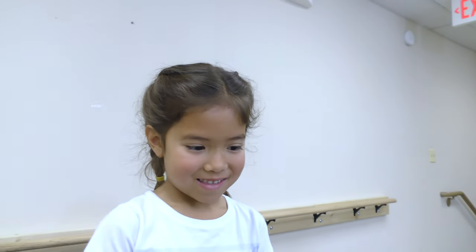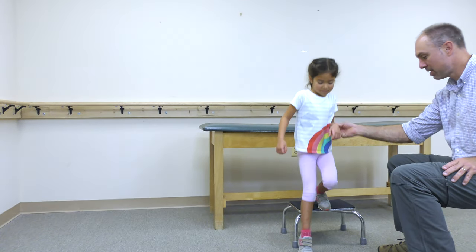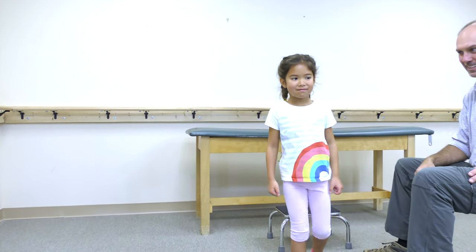Next, walk around and see how they feel. Let your feet be your guide. You may have to make some slight adjustments.